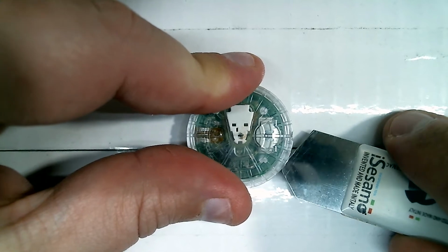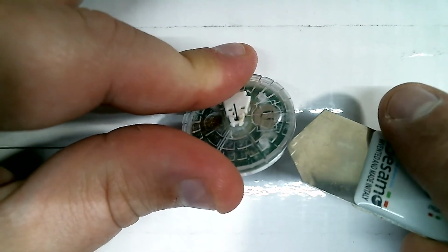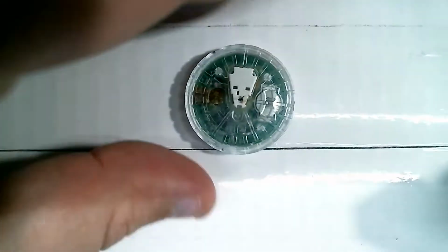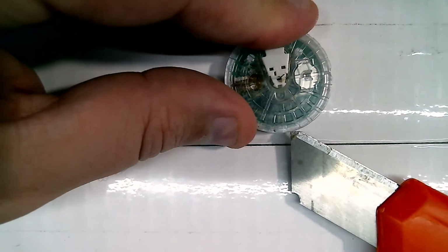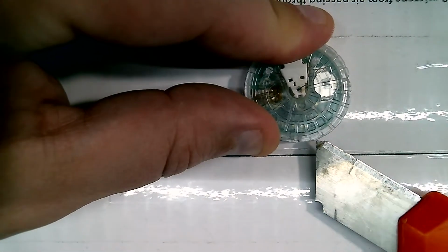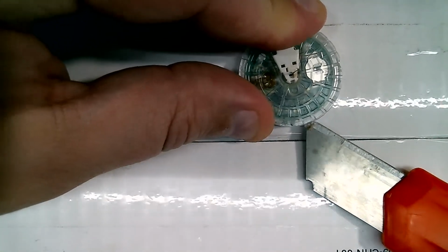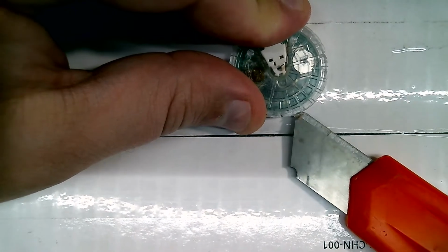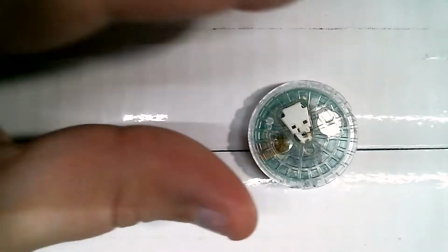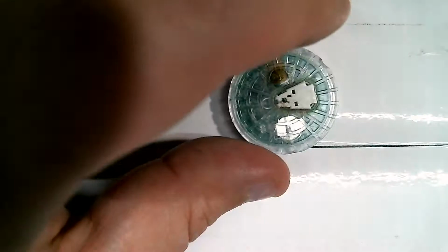Probably because this thing is waterproof, it's probably going to be very, very stubborn about coming apart. So I will do my best not to make this horribly nauseating, or for that matter, to cut my damn hand open. Or not. That does not want to open, does it? I don't even think I made a dent in it either. Alright, maybe we need to approach this from a different angle.